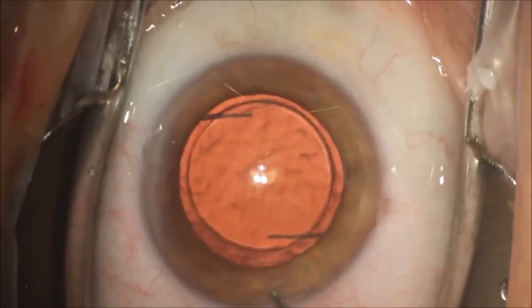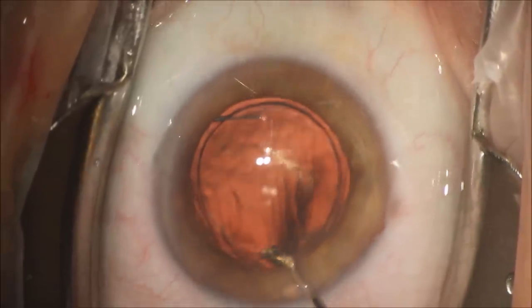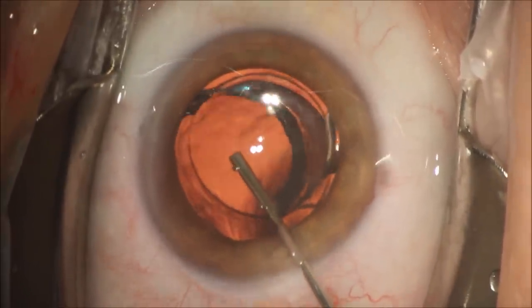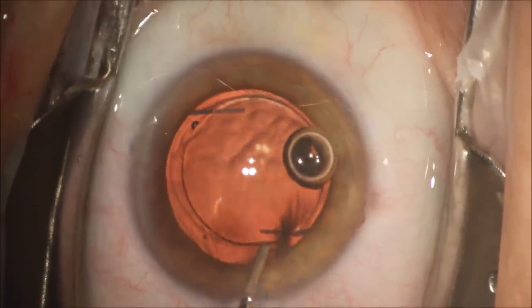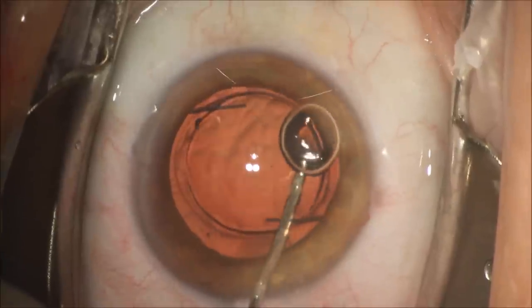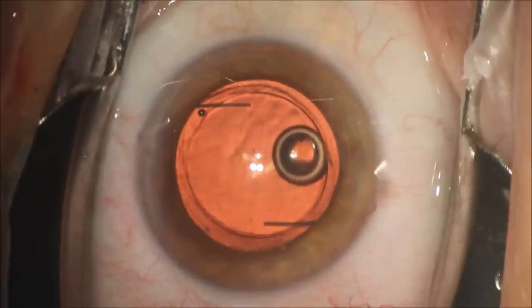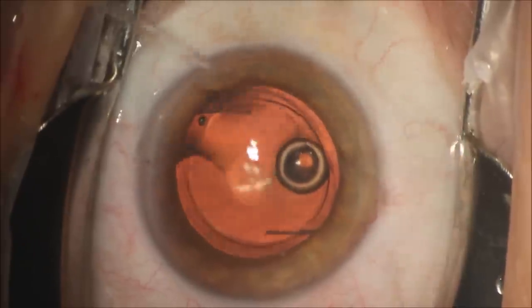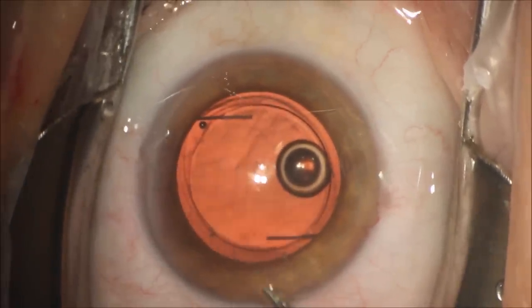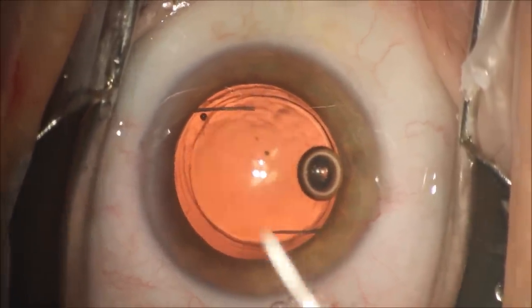We're going to fill the anterior chamber with a dispersive viscoelastic, and we try to get under the intraocular lens with the cannula. You can see an air bubble and viscoelastic underneath the intraocular lens, and this will free some of the adhesions of the lens to the capsular bag. This is a silicone lens, a Bausch & Lomb LI61AO, that is not as sticky as some of the acrylic lenses, so it's easier to free from the capsular bag. The haptics are very thin and do not cause much scar tissue.